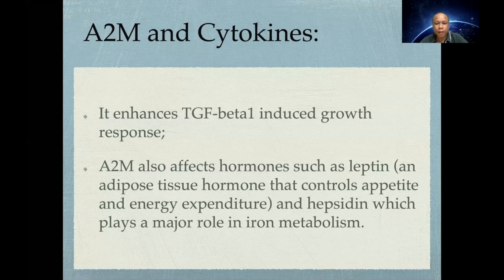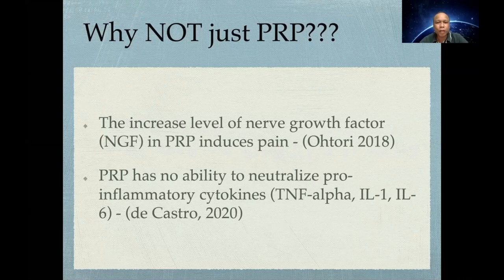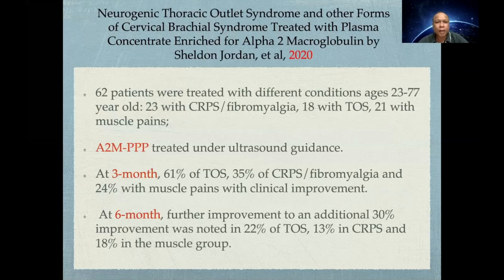So why not just PRP? Because, as we have mentioned, the level of PRP with its NGF also contributes to the pain, and PRP has no ability to fully neutralize the pro-inflammatory cytokines such as TNF-alpha, interleukin 1, and interleukin 6. So here, A2M, and A2M usually is taken from the platelet poor plasma portion and under ultrasound guided procedures.